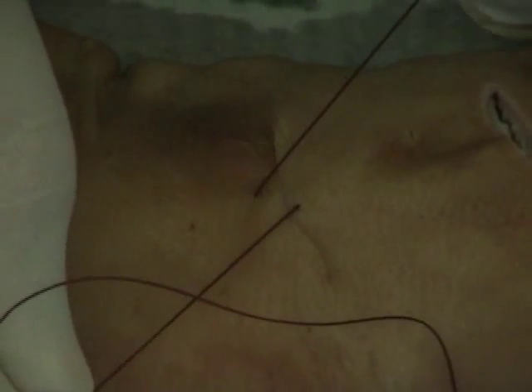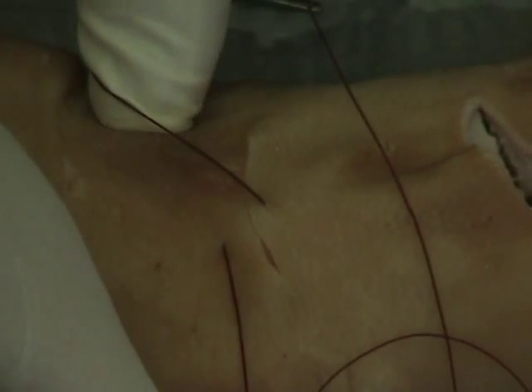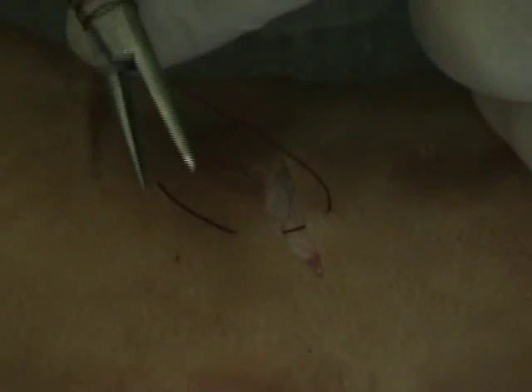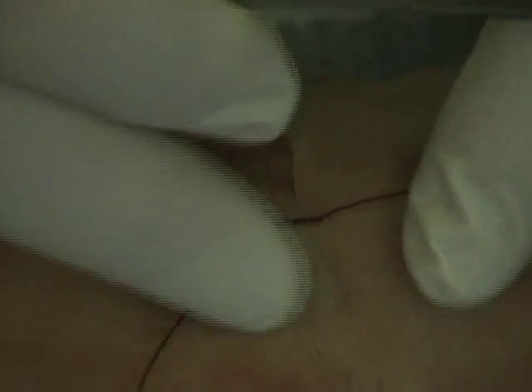But you can see if it was accentuated more, what would tend to happen would be that we would end up getting a much more pronounced dog ear. So this will work for us. It probably isn't perfect, but it should close certainly fine for us, and everything should be fine. So this first stitch, I'm going to pull it across, snug it up, okay? And again, now when I look at this, I am seeing a little bit of a pinch there, a little bit of a pinch here, but everything is going to come together. I can flatten everything out, and everything should come together very nicely.